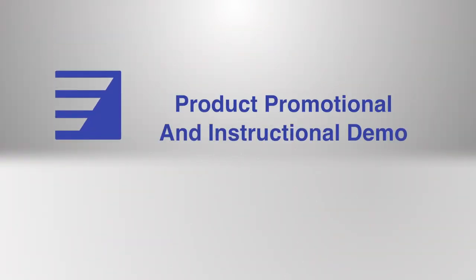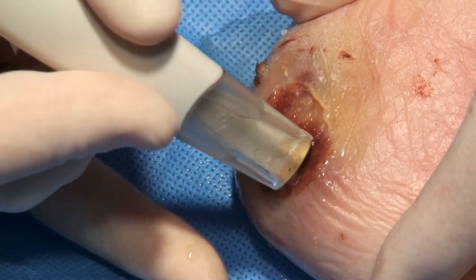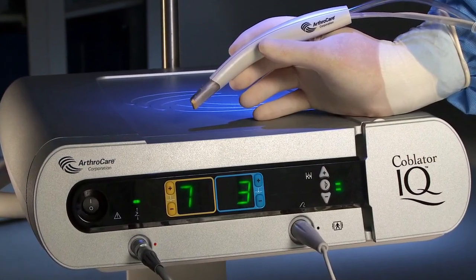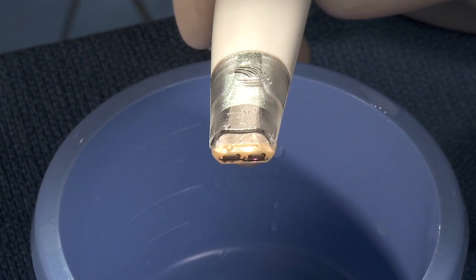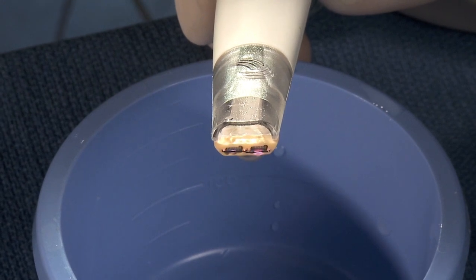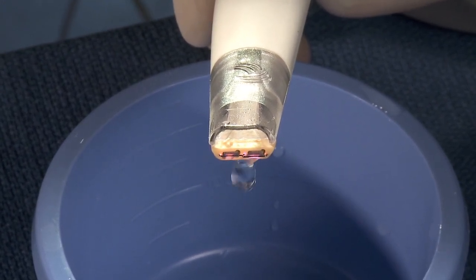Wound care and debridement technology have recently advanced to provide physicians with a novel and efficient means for managing acute and chronic wounds. The Wound Wand debridement device utilizes the revolutionary ArthroCare Coblation technology. Coblation technology uses radiofrequency energy to excite the electrolytes in a conductive medium, such as saline, creating a precisely focused plasma field.